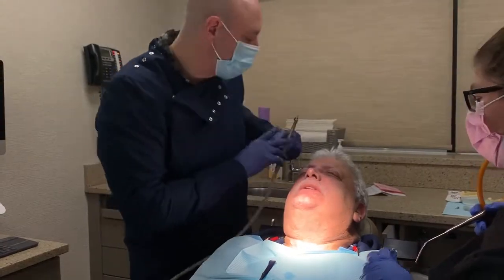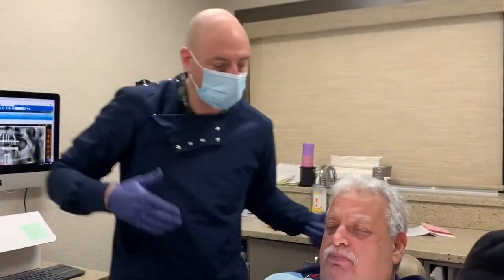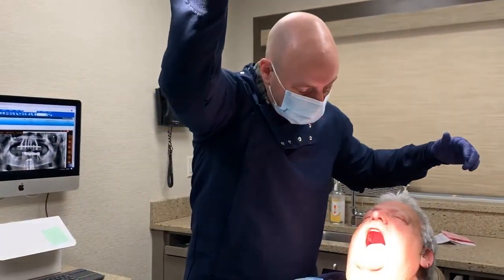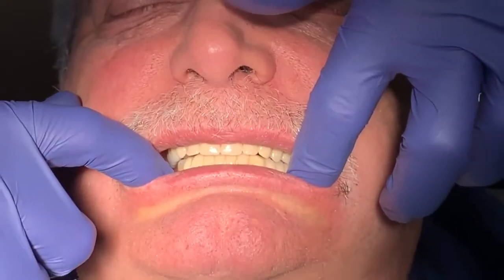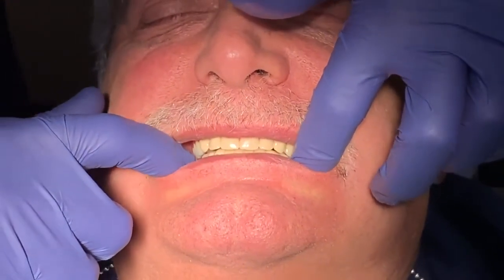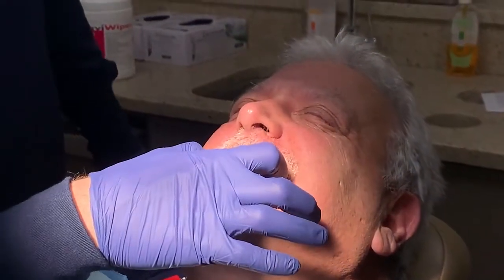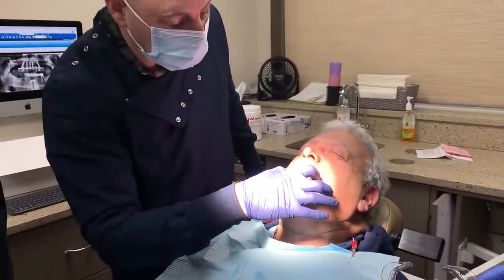Now, again, I don't want to have a really deep bite on him. I don't want to have excessive vertical overlap. And so this is what we talked about at the beginning, and this is what we're talking about now. And bite down. Yeah, if I remember, he did have his original setup. It was like this. Yeah, deep bite. And slide your teeth forward. Keep coming forward. And go side to side for me. Good. Okay.